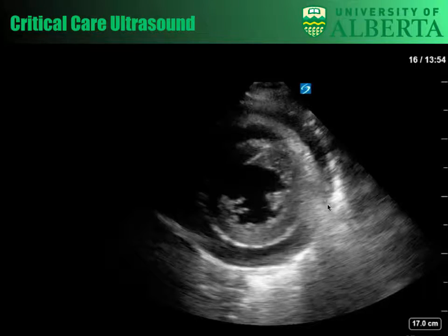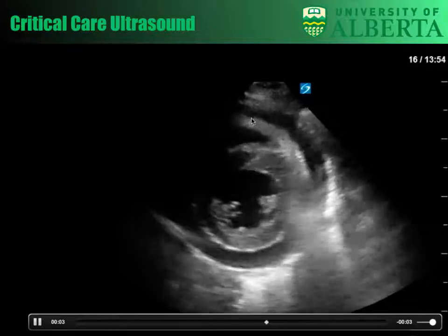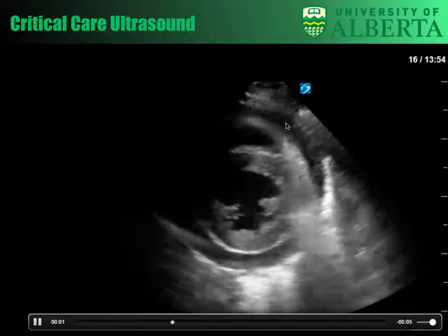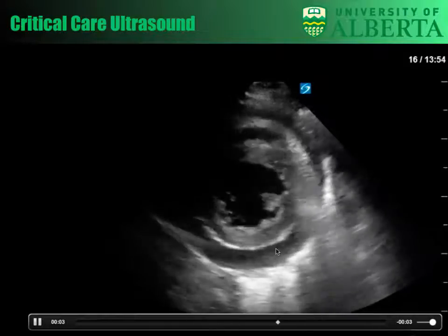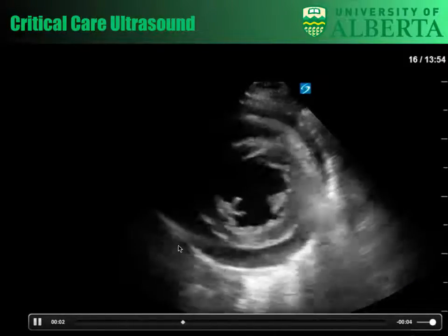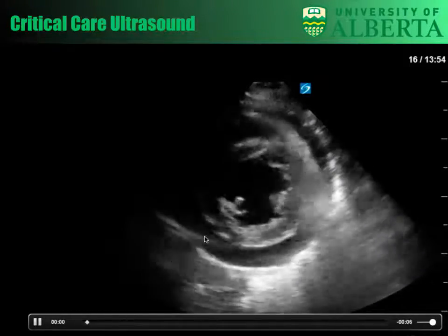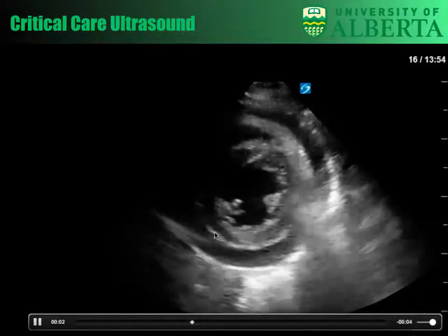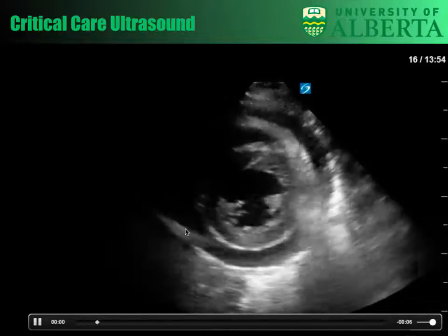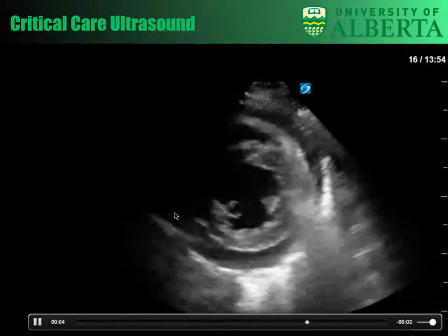Okay. So LV, RV, we see anterior, there's a circumferential fluid surrounding the heart, it's anechoic. Overall, looking at the LV, it doesn't look like you have great LV function. There's not a lot of squeeze here. Yeah, I think that's most of what I see. The LV doesn't look great. Yeah. There's circumferential fluid. That's great.